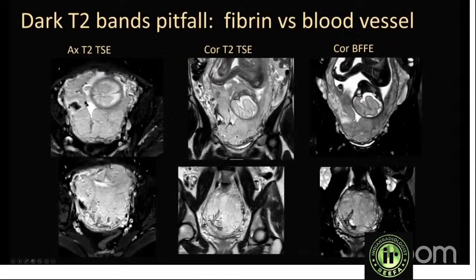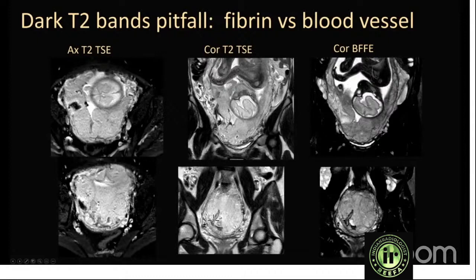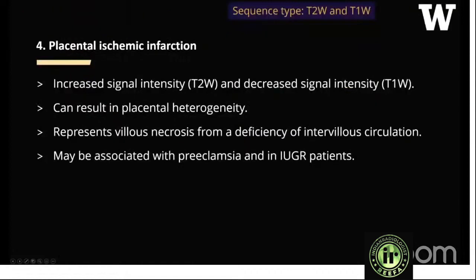An example from our institution: axial T2, coronal T2, and balanced FFE sequences. A dark intraplacental band was seen in one region — on balanced FFE that area appeared bright, consistent with a blood vessel, not a fibrin band. In a different region of the same patient, the dark intraplacental area remained dark on balanced FFE — confirming it as a true dark intraplacental band from fibrin deposition. Balanced FFE images are quite helpful for differentiating dark bands from blood vessels.